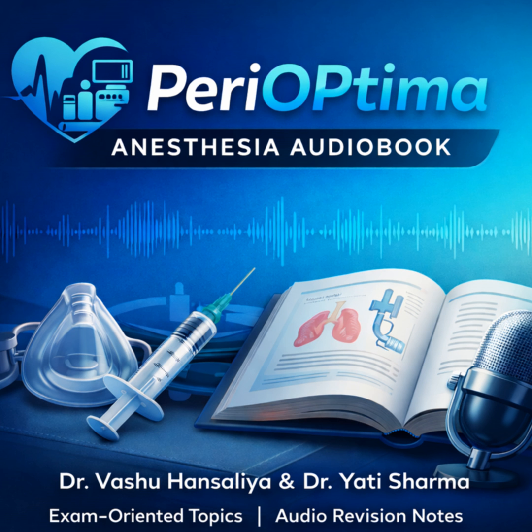Let's detail the top 3 devices, starting with the innovator of the second generation, the ProSeal LMA. The ProSeal is really distinguished by its design refinements. It features an additional posterior or dorsal cuff, which acts to push the mask forward against the peri-laryngeal structures, and that significantly improves the seal. It has a robust double tube arrangement, the reinforced airway tube and the drain tube, which prevents the device from rotating once it's seated. It also incorporates a built-in bite block to protect the tube. Clinically, the ProSeal achieves a seal pressure of 30 centimeter H2O, a substantial improvement over the classic LMA.